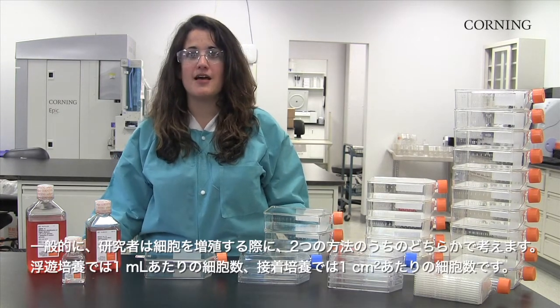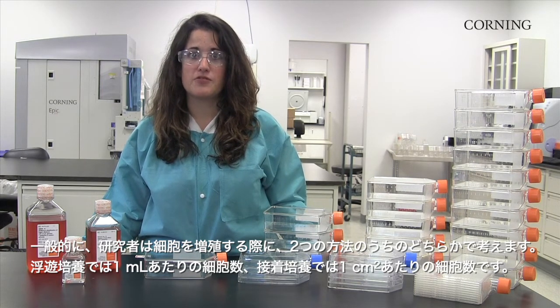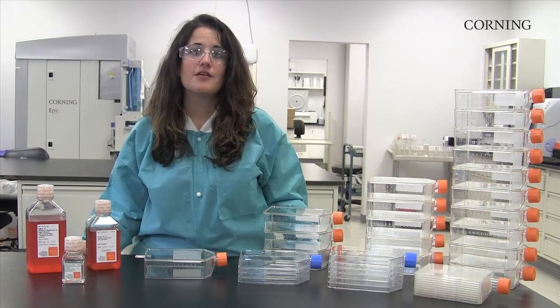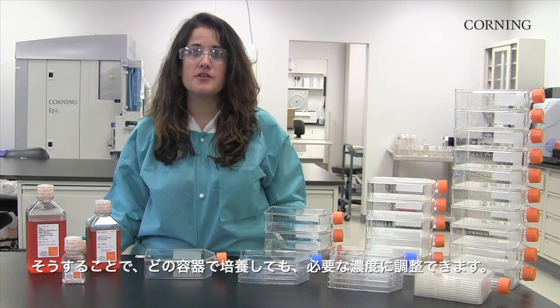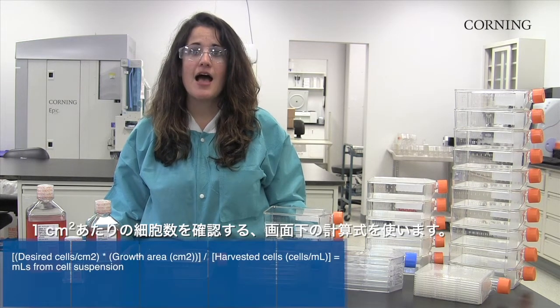Typically, when expanding cells, researchers will think in one of two ways: cells per mL for suspension-based cultures, or cells per centimeter squared for adherent-based cultures. For adherent-based cultures, not all cell culture vessels have the same growth area, and when expanding cells, it's easier to expand into larger vessels by calculating cells per unit area. Therefore, you can expect your cells to be at the density you want, when you want, regardless of what vessel you culture them in. To see based on cells per centimeter squared, I would use the formula found at the bottom of the screen.